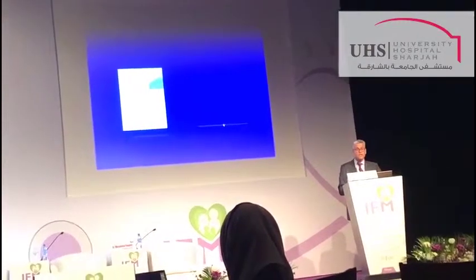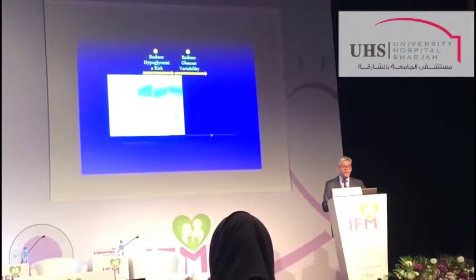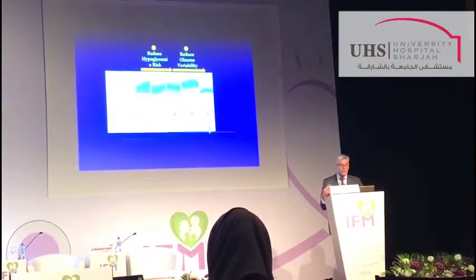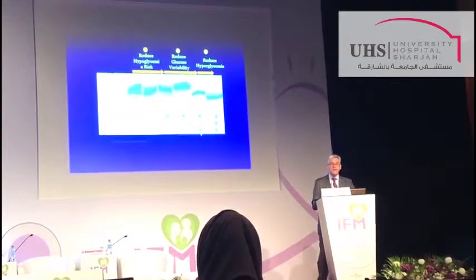If you want to make it even easier for yourself, you can dissect it down, okay? And just look at what I have told you. Low blood sugar, because you want to reduce the hypoglycemia, the median glucose, and the variability. So the first thing is to look at whether your patient has any hypoglycemia or not. The aim is to reduce it, of course. The other thing is to reduce the variability, and then to eliminate the hyperglycemia.